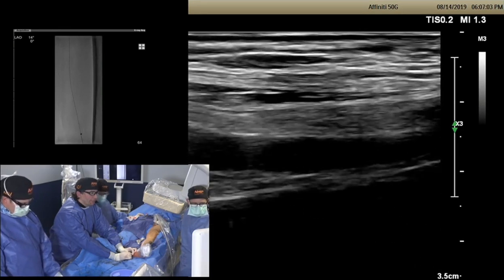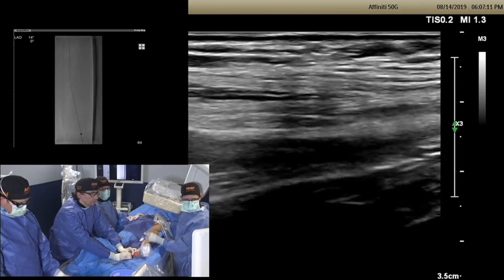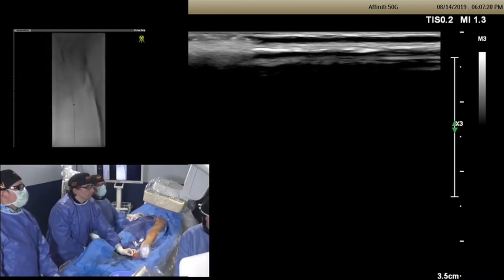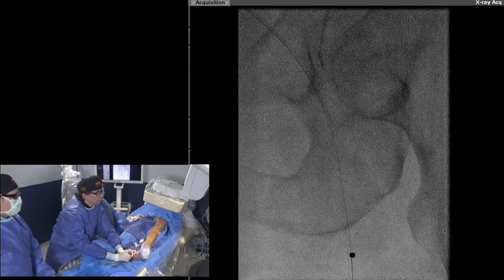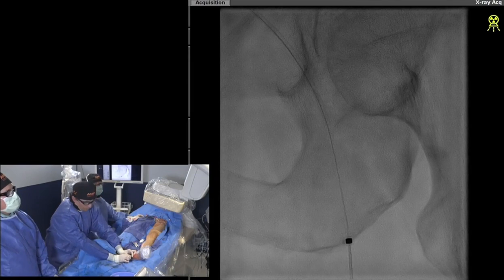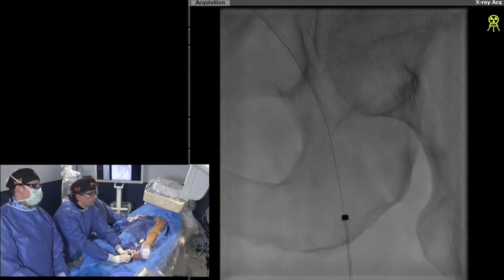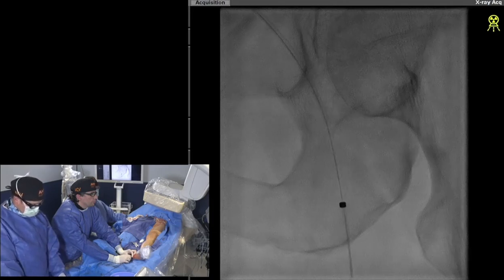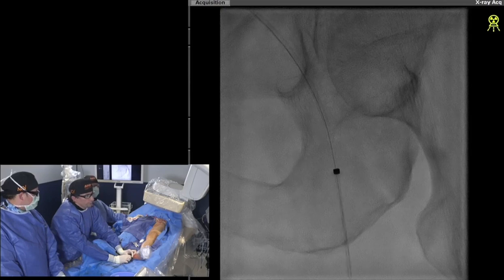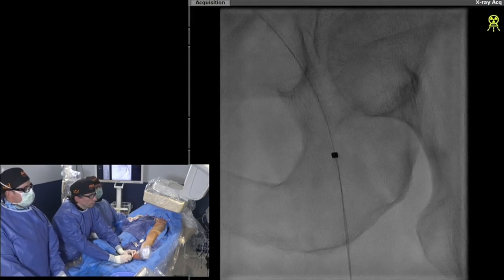I'm going to be much better — see now the entire lumen is filling. Would you agree that trying to rush through complex cases is when bad things happen? No matter what atherectomy device you're using, going slow and being deliberate is better. Faddy and I wrote a paper together: 'Go slow to finish fast' for atherectomy. When you go fast and embolize, it's a disaster. For laser especially, if you go very slow you can catch up. Going at a half millimeter to a millimeter per second is the key.